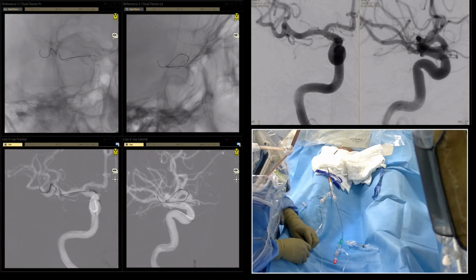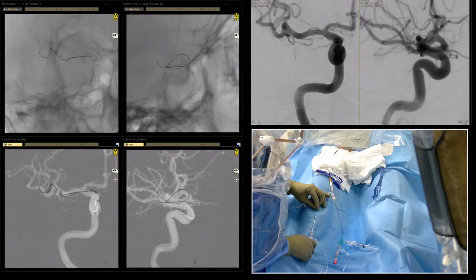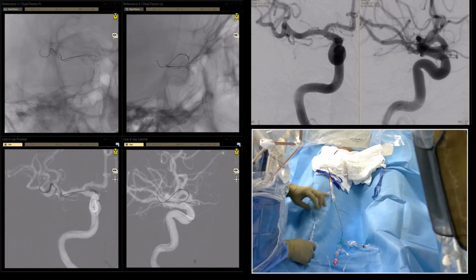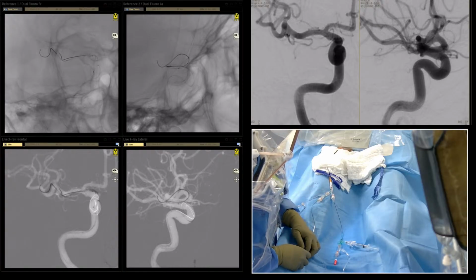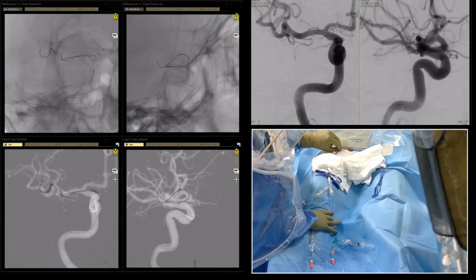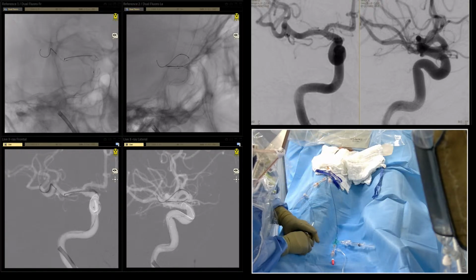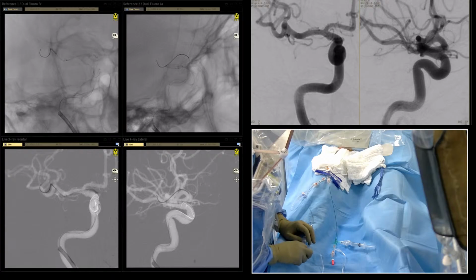Yes, there is a problem. It's not a one-to-one movement. At some point, I think there is a... Okay, just a second. I will take up my... This is for Buki. That's why we can do it more actively. Let's look like this.